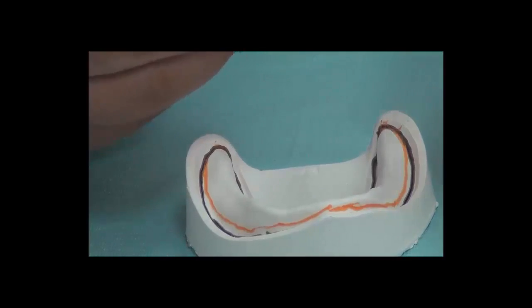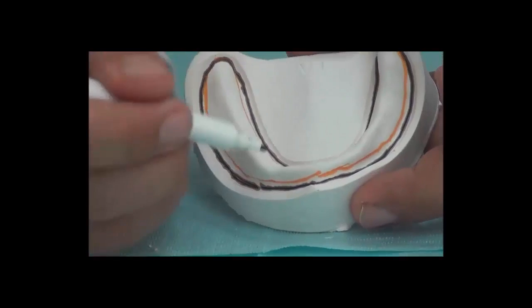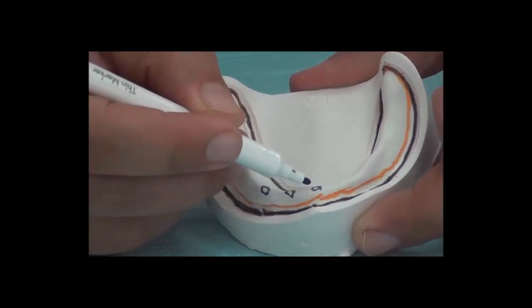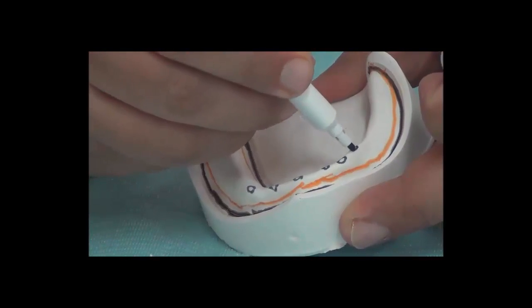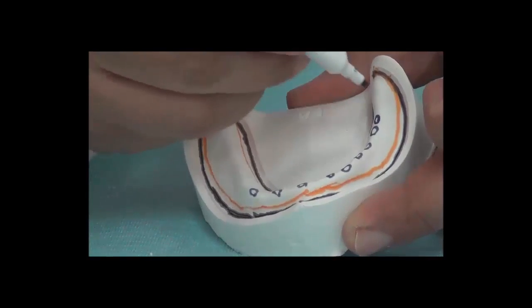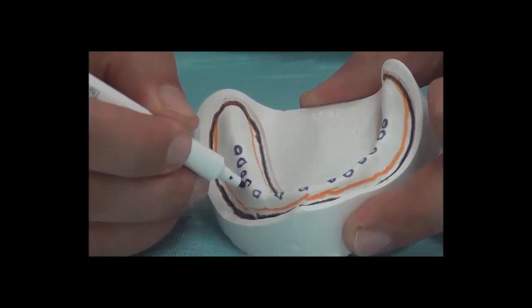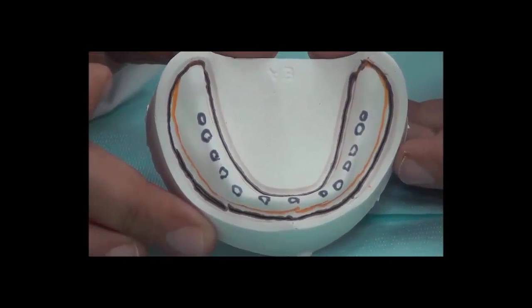Once we have our material ready, we are going to place holes in the areas where we need to have relief. So the holes in the tray will be over the canine eminence, over the crest of the ridge anteriorly, the canine eminence on the other side, the crest of the ridge, excluding the retromolar pad. The retromolar pad should be compressed in denture impressions. So we can apply these holes in the tray once it's there.